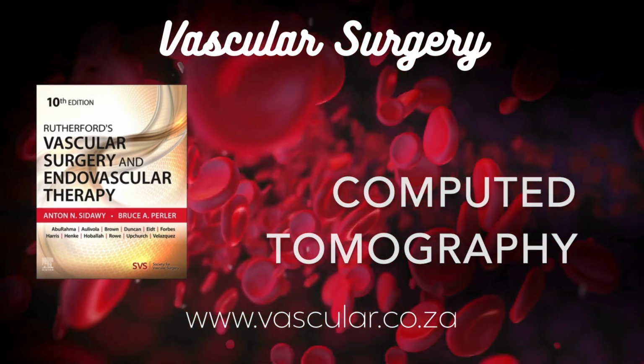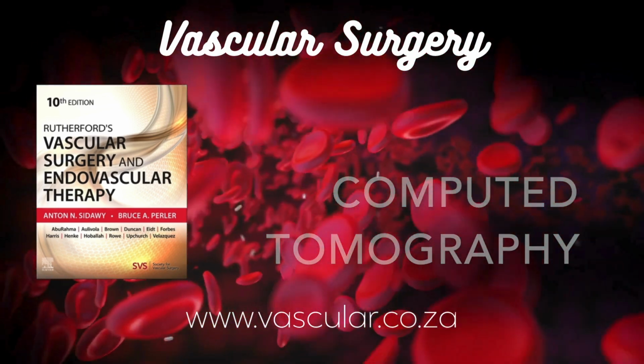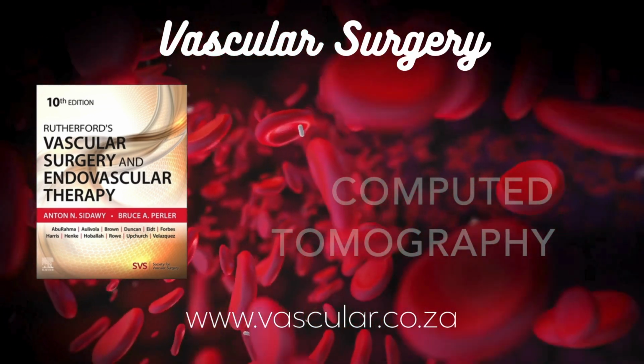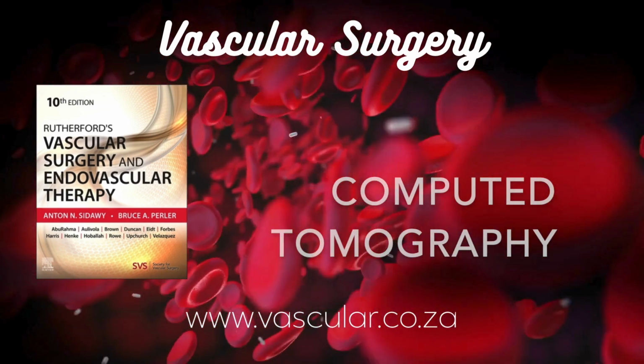But for leg veins, like DVT, for peripheral veins, duplex ultrasound is usually the first choice. It's non-invasive and gives flow information. If cross-sectional imaging is needed for veins, MR venography, MRV, is often preferred over CT.